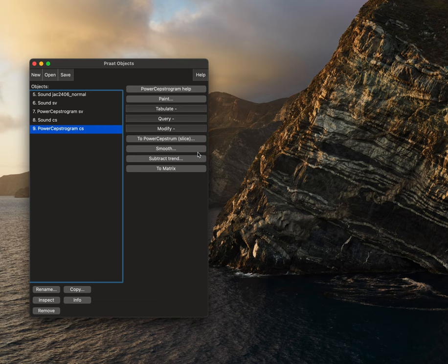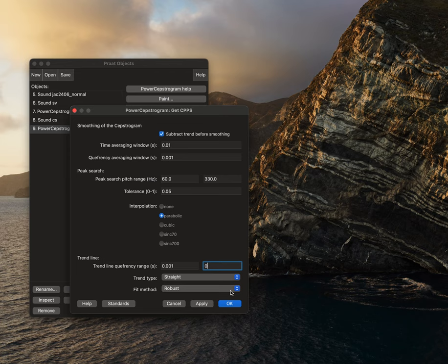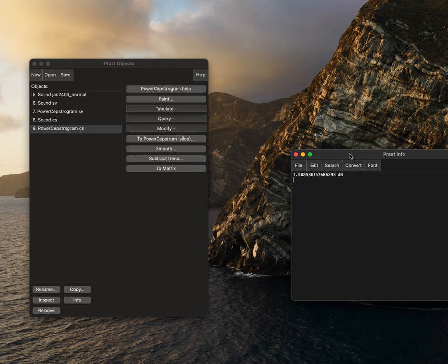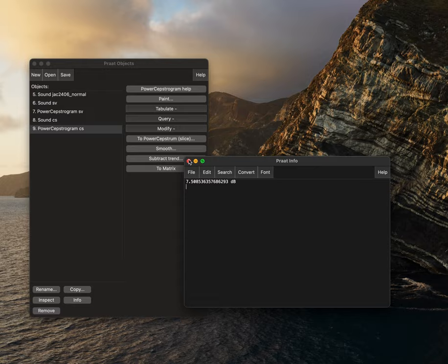We'll then do the same process of analyze periodicity to power cepstagram. Click OK. We'll analyze this by going to query, get CPPS. We see that our settings are all how they should be. So now we'll click OK. Now with longer speech samples, this can take a little bit longer. This was actually relatively quick. But here we can see that the cepstral peak prominence was 7.5.